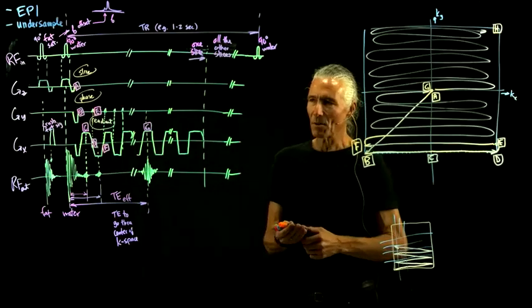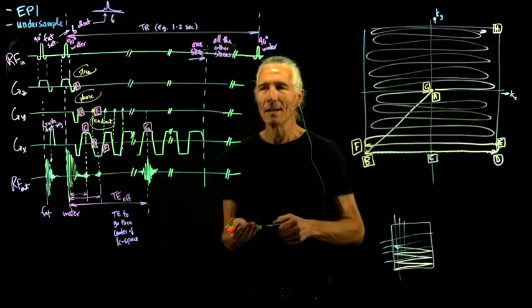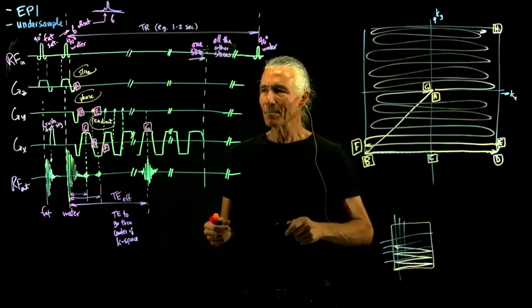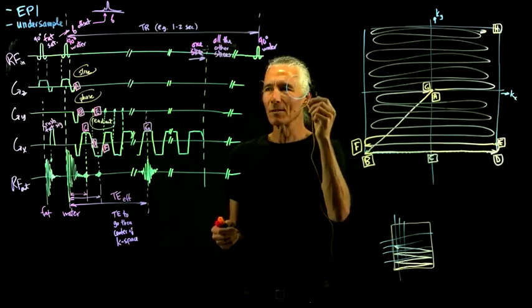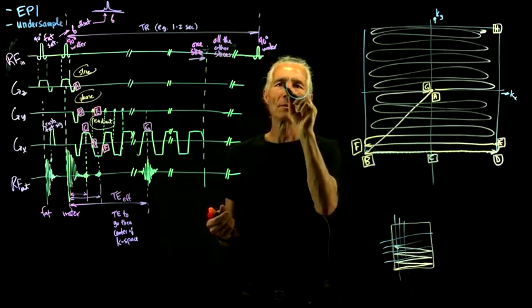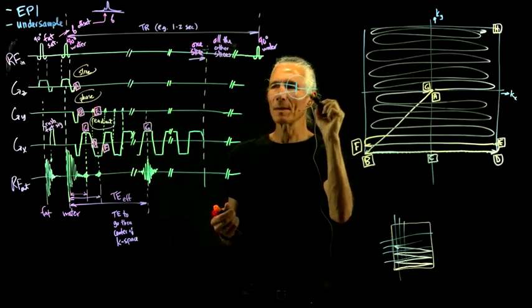What is the main reason that made this possible? It's mainly improvements in amplifiers. A transistor is like a multiplier: you've got two things coming into the transistor and one thing coming out.